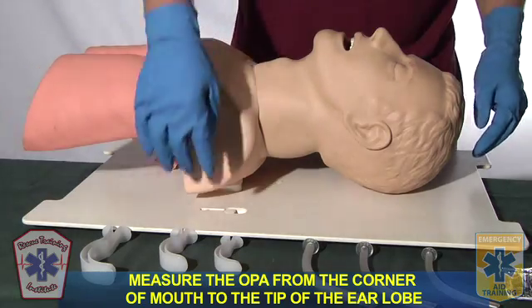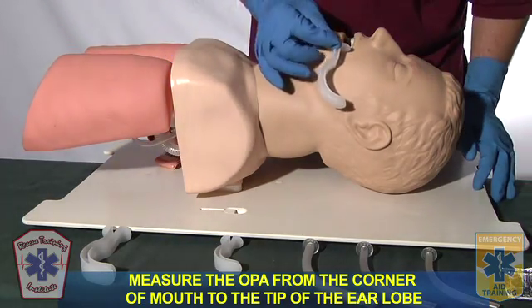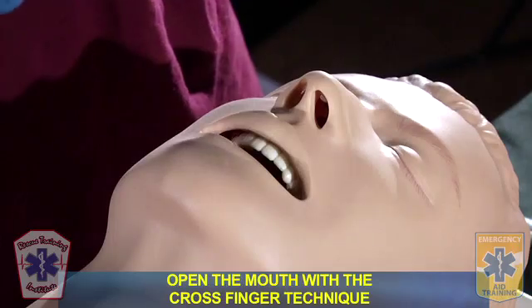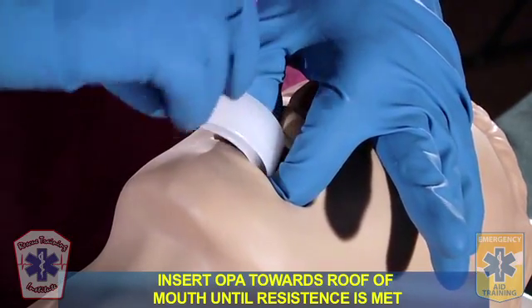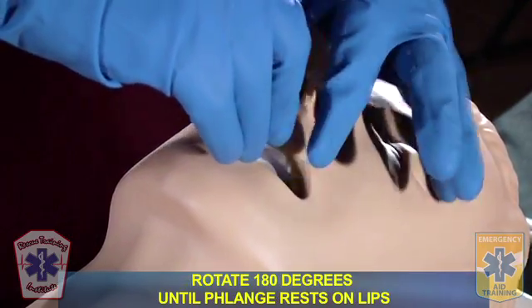I have my BSI. I'm going to select my appropriate size oropharyngeal airway by measuring from the corner of the mouth to the tip of the earlobe. To open up the mouth, I'm going to utilize the cross-finger technique. I'm going to insert the oropharyngeal airway towards the roof of the mouth until I meet resistance, then rotate it 180 degrees until the flange rests on the lips.